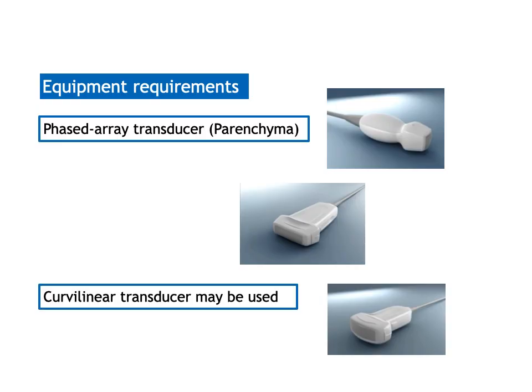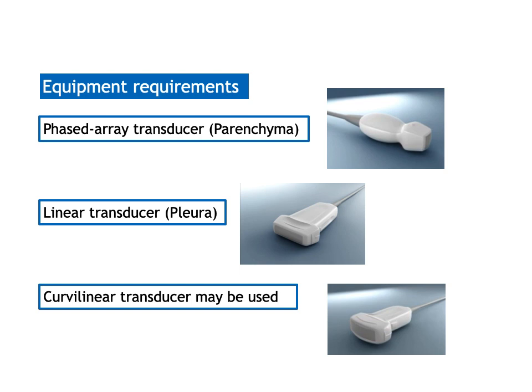scan. So moving next to the equipment required, these are the important ultrasound transducers that we can use for scanning the lungs in patients with COVID-19 and doing the ultrasound scanning in general. The universal probes are the linear probe, the high frequency probe, which is a probe that is used to scan the pleura, and the curvilinear probe, commonly known as the abdominal probe, is a low frequency transducer, so it has a depth of penetration, and it is useful to scan the parenchyma of the lungs.